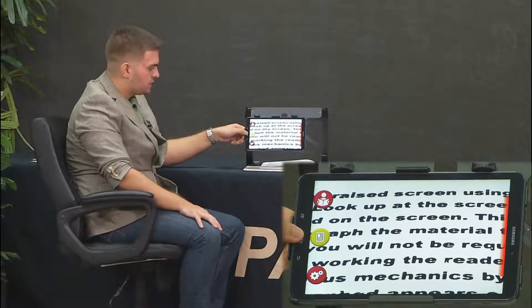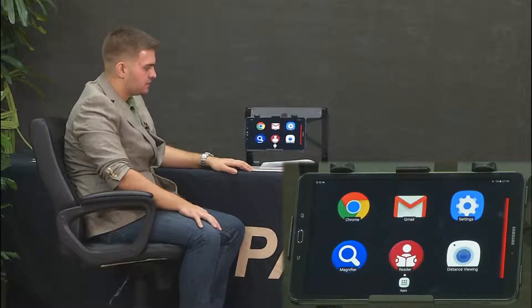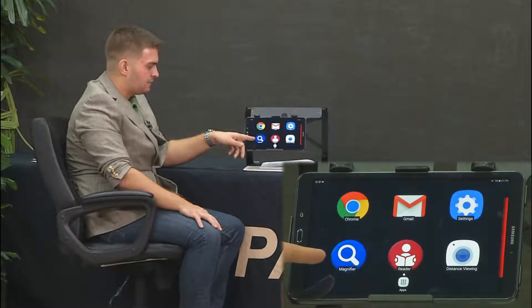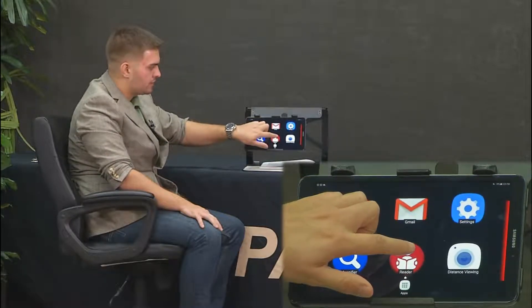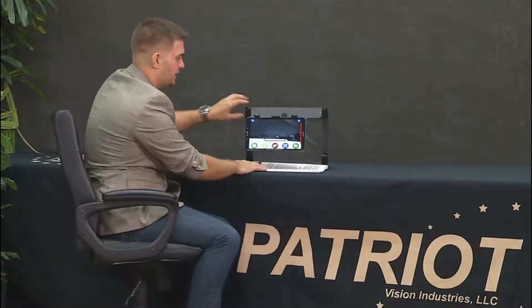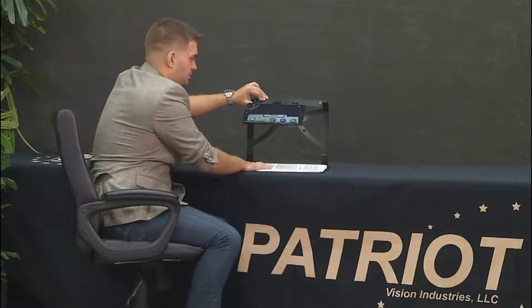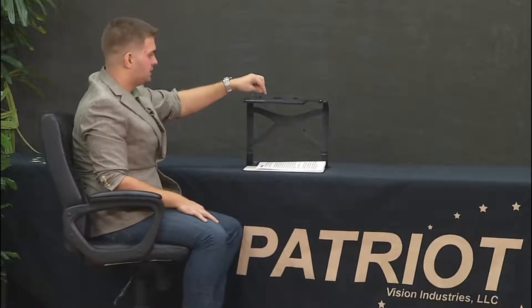I'm going to press the home button to get back to the desktop of the Android based operating system. On the desktop you have not only the magnifier but also the reader icon that you can open up directly. When you open the reader icon, you can actually take pictures of the document by tilting up on the tablet.